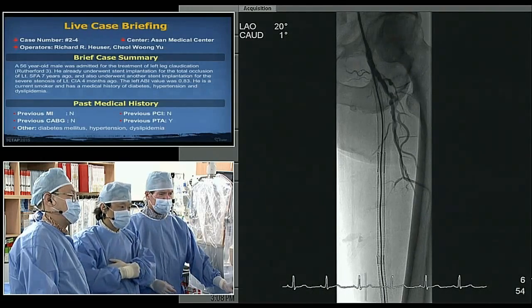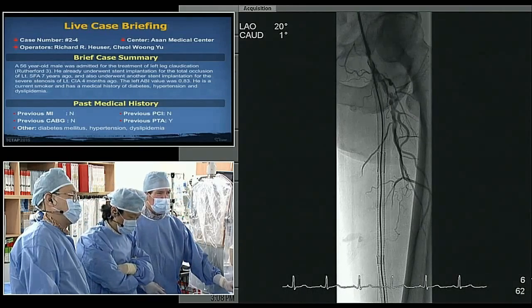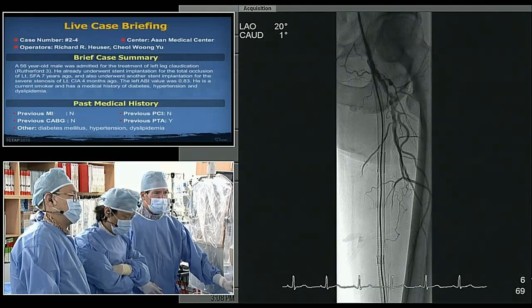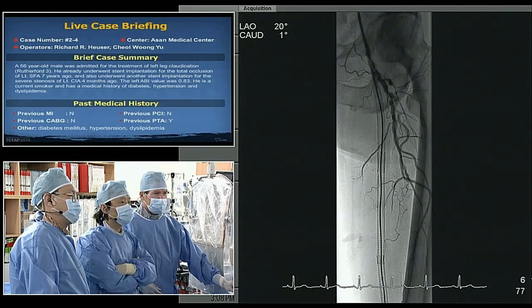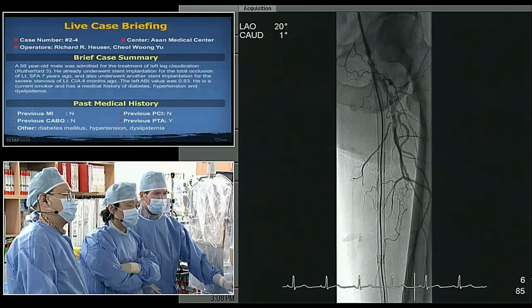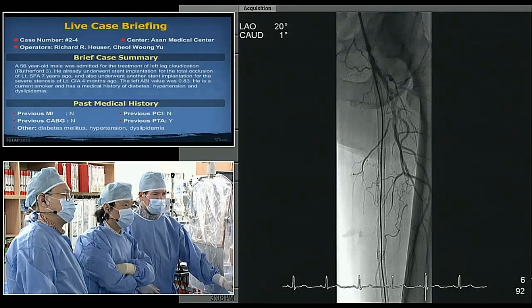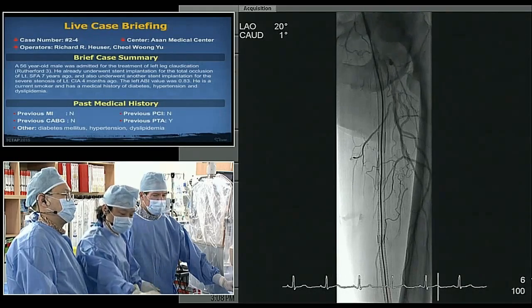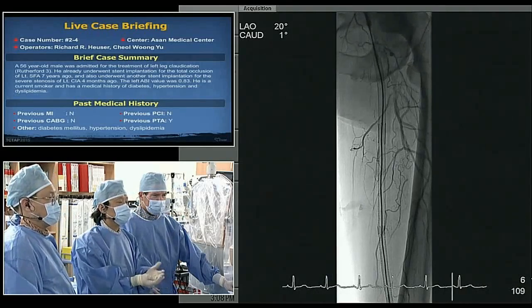Well, if you go back to the data for in-stent restenosis, at least in the U.S., the data would suggest that laser as a primary therapy may have a better benefit. It's a low bar, though. Their primary patency was still only in the 40s compared with the angioplasty alone arm. The Reline or DCB market seems to be fairly attractive if you go down the road of an atheroablative technology. And it seems useful, particularly if it's thrombotic, because it will generally get rid of the thrombus as well as the hyperplasia.